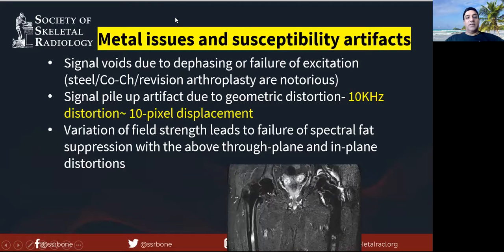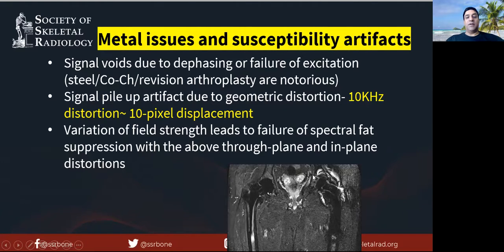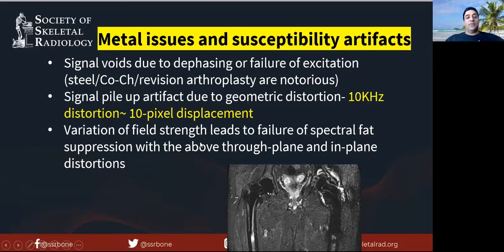Metals result in signal voids due to dephasing and failure of excitation. Some metals are very notorious, like steel or cobalt chromium in revision arthroplasties. This leads to signal pile-up artifact — the white areas — due to geometric distortions. Typically, a 10 kHz distortion leads to a 10 pixel displacement, so the protons are displaced. There is also variation in field strength which leads to failure of frequency-selective fat suppression, resulting in through-plane and in-plane artifacts and signal voids.